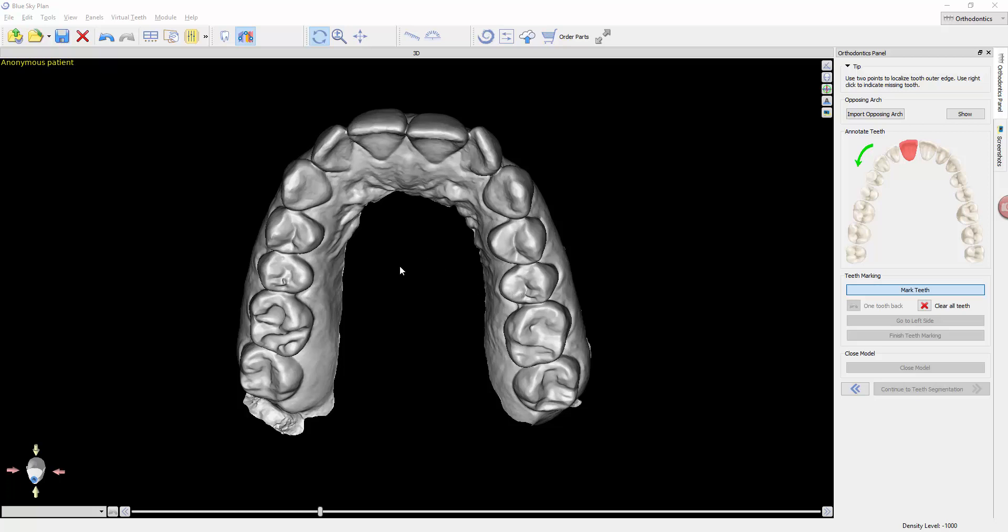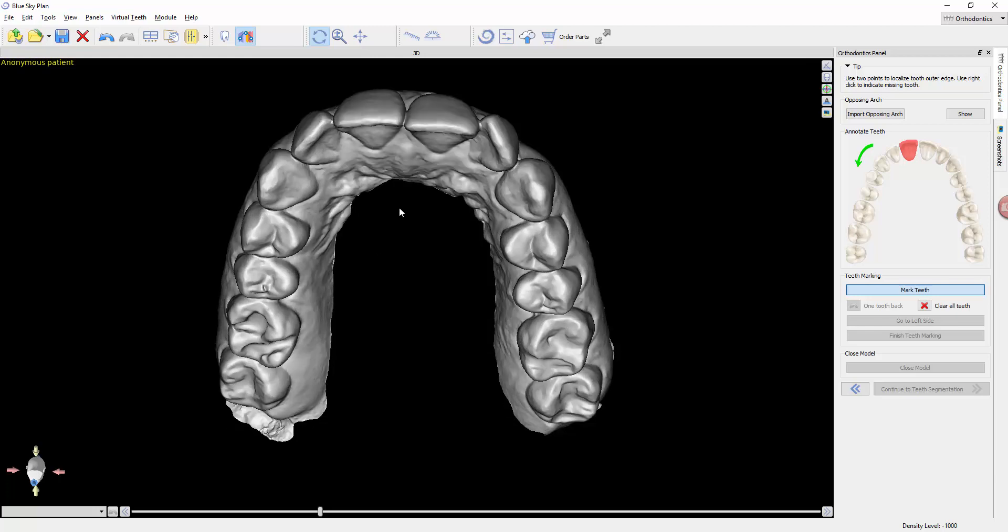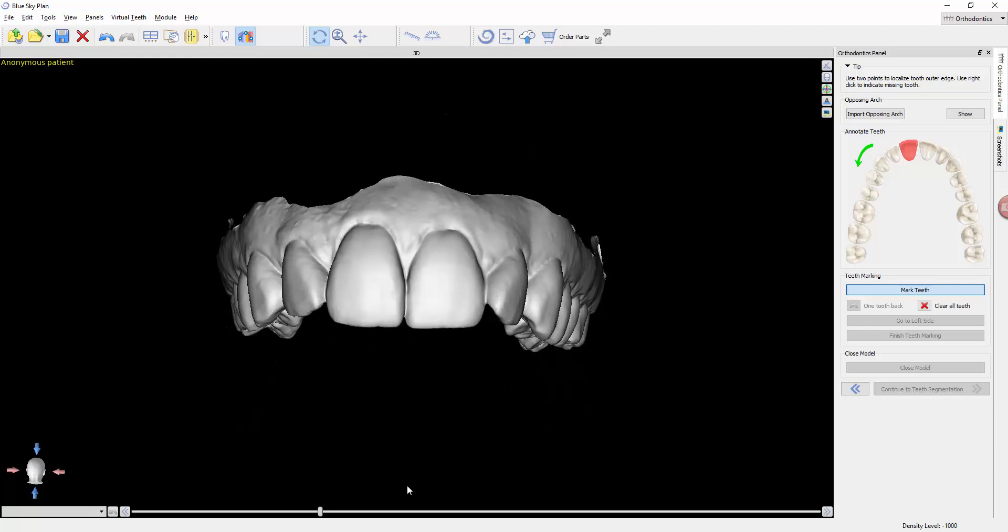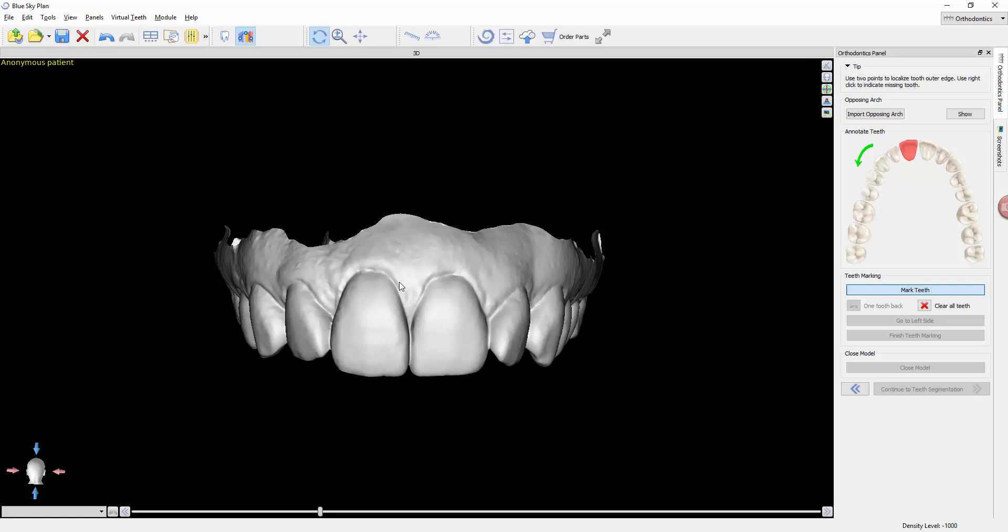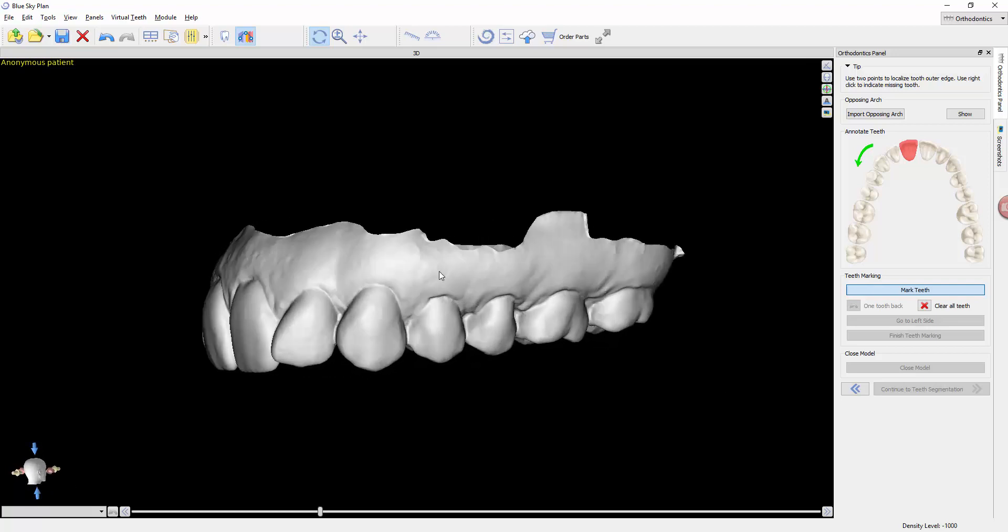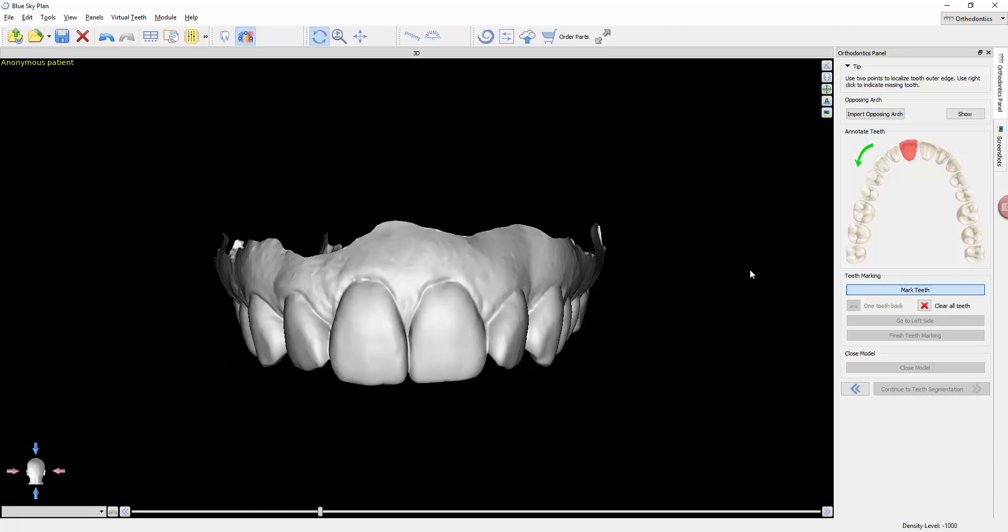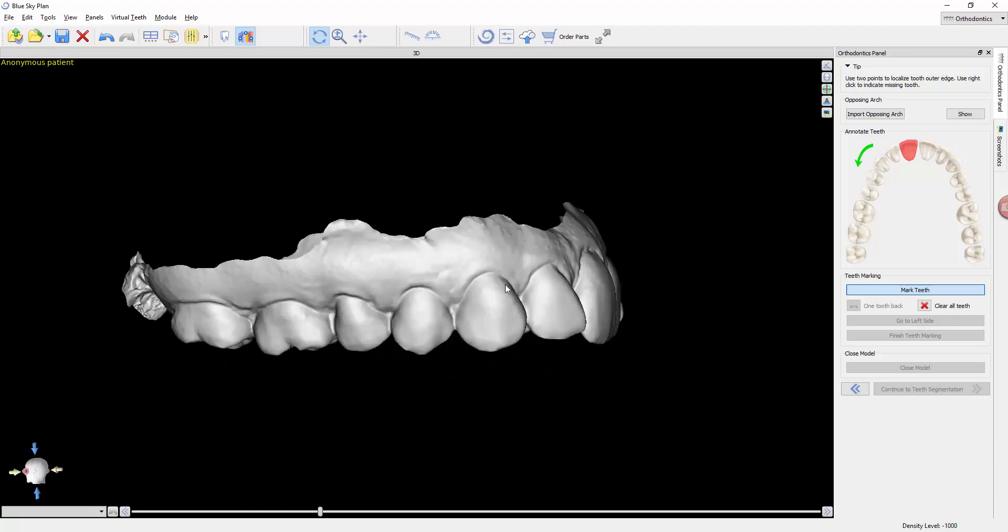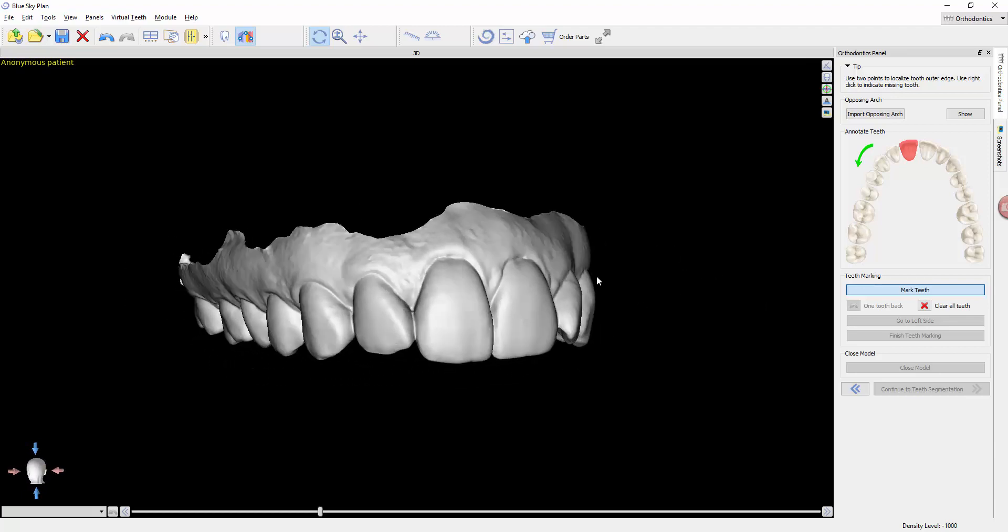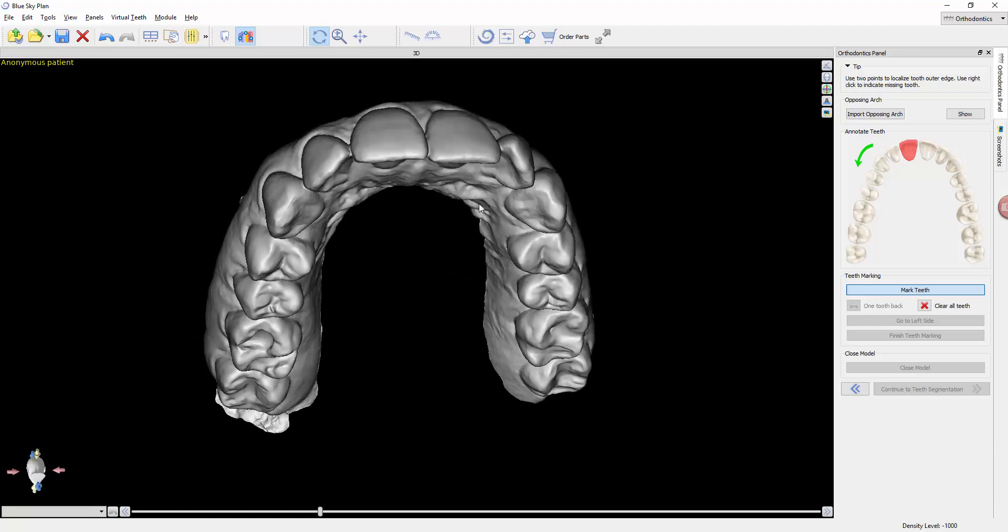In this phase of the module, we're going to be telling the software where the teeth are. One key point I want to point out is that if I roll the model forward so it's looking right at me, you can see that you're actually looking at the back of this little skull. That's because the software doesn't know how the models align to the 3D environment.